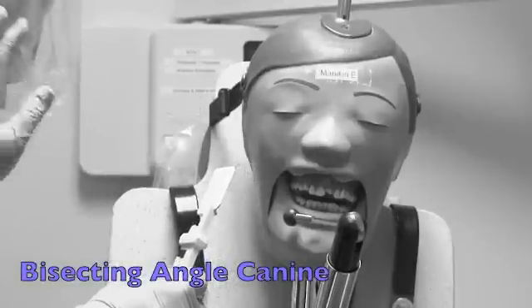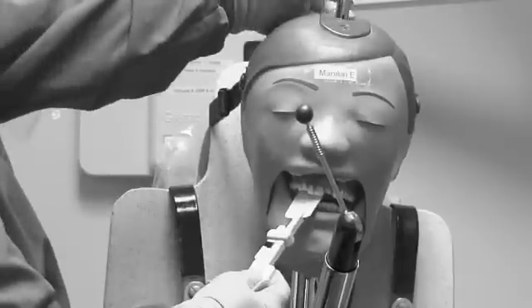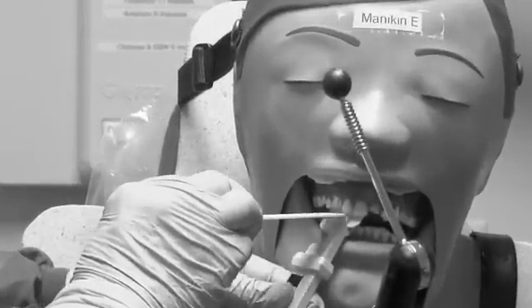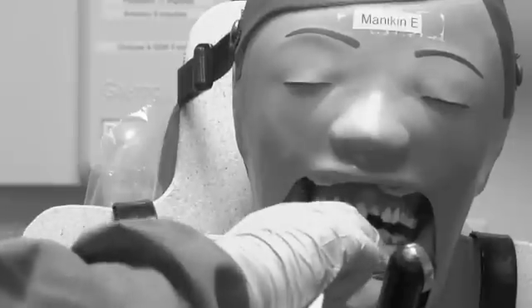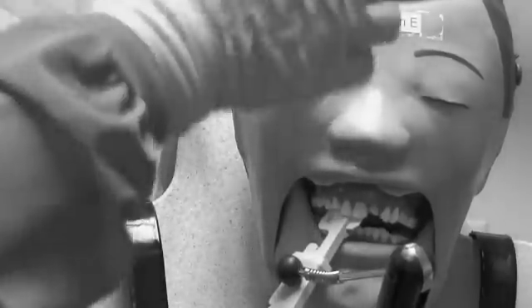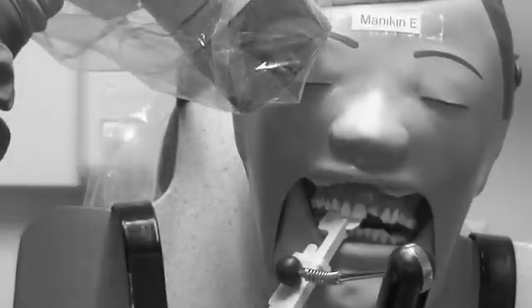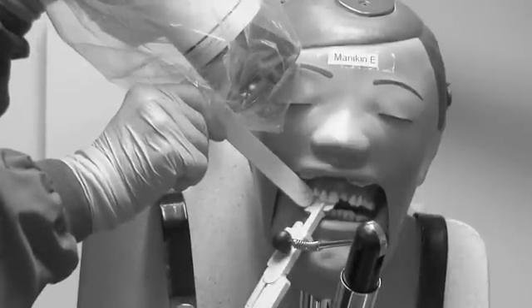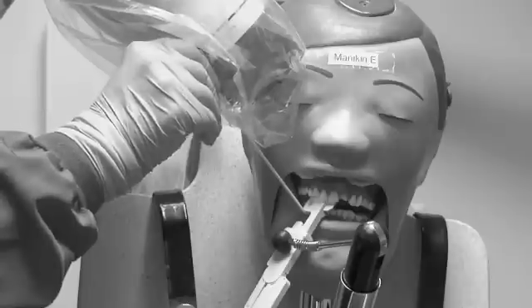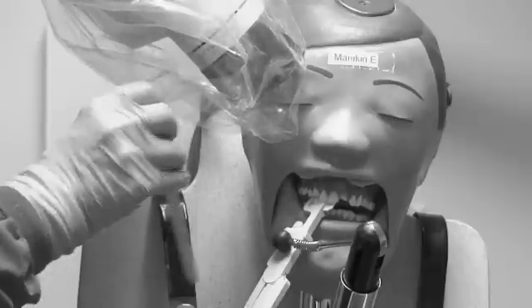We set our angle at 45 because we're going to do the canine view. We're going to put the dot in the anterior part of the holder and place it behind the canine, pulling it tight up against the palate. Make sure you have that little space, because now you're creating the border of your film. Have the patient pull it down towards their chin, with the tragus-ala line parallel to the floor. To open up that contact, line everything up with the bottom of the holder, then come off to the side and be parallel to the distal of the canine. Make sure you're at the end of the holder. This way we will foreshorten the film, but we'll always be sure the distal of the canine is opened up. By going around the bottom of the film, you know you're not going to cone cut.